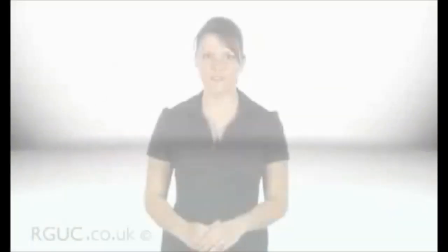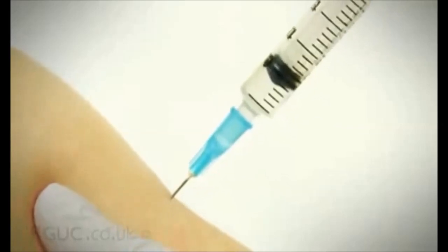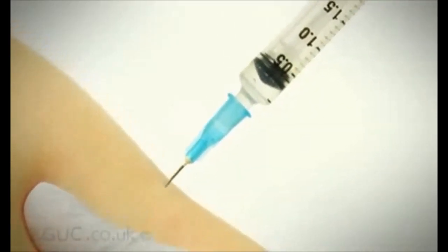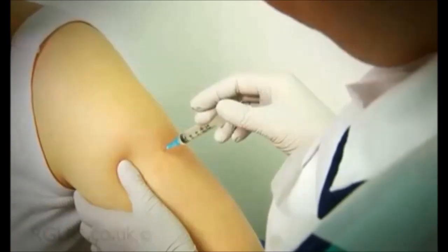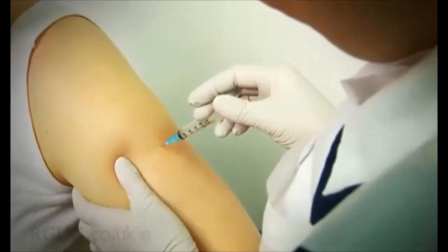Aspirate the needle, observing for blood return. If this occurs, it means that the needle is in a blood vessel. Withdraw the needle, discard the syringe and restart the procedure. If no blood is aspirated, inject the drug slowly into the selected muscle at a rate of 1 milliliter per 10 seconds. Once the medication has been given, remove your finger from the skin surface, allowing the layers to return to the original position, trapping the drug.